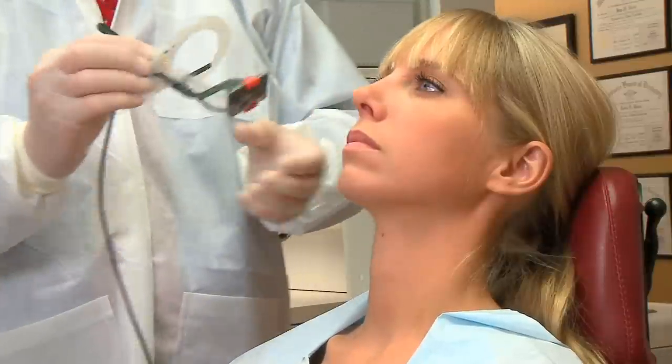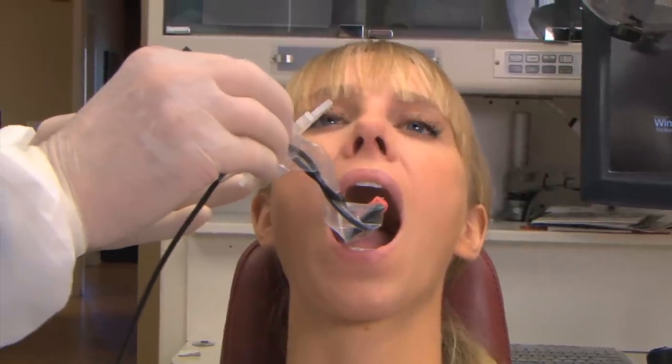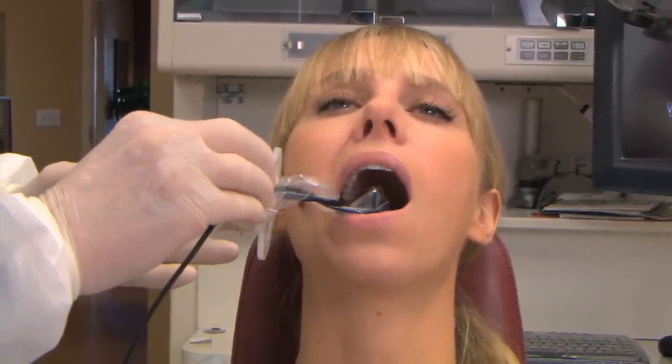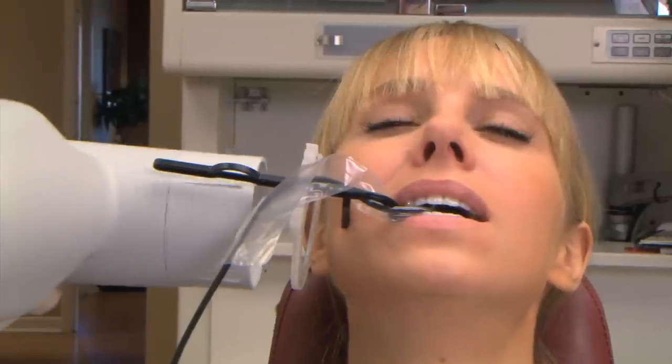Then you're ready to do the bite wing images. Go in on a 45-degree angle into the lingual side of the tongue. Place the sensor, turn and push to the midline. Tell the patient to close gently. Align the cone with the aiming ring and take the x-ray.